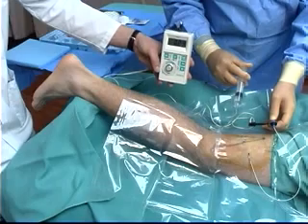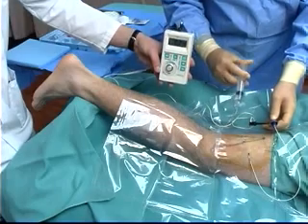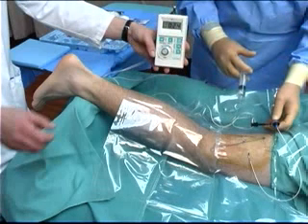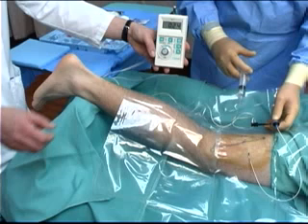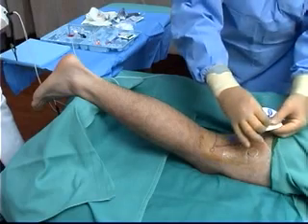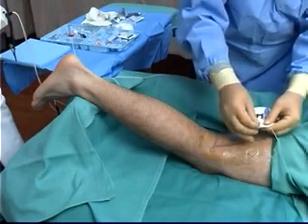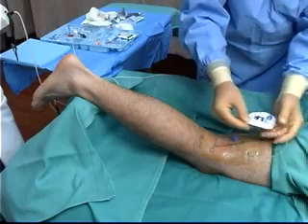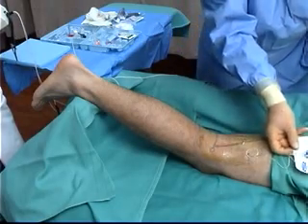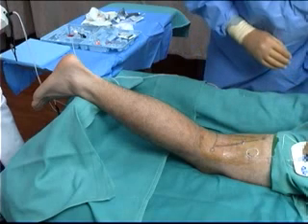In this instance, this fluid is normal saline. The motor response disappears immediately upon injection, which is a positive Raj test and a further indication that the primary and secondary blocks will be successful. The catheter exit site is covered with a transparent dressing to allow daily inspection. The snap lock and catheter are placed in the Stat Lock, which is in turn attached to a convenient place on the leg. The main dose for the block can now be injected through the catheter.